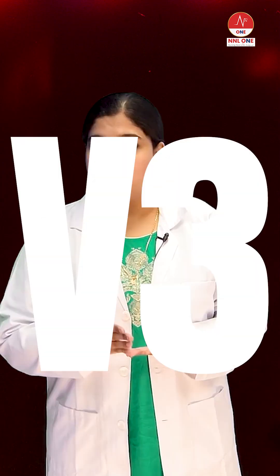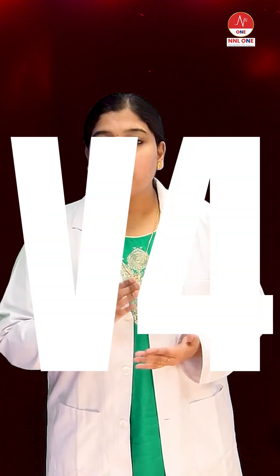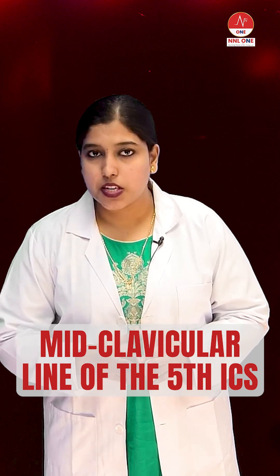Next is V3. V3 is always placed midway between V2 and V4. And V4 is placed in the mid-clavicular line of the fifth intercostal space.